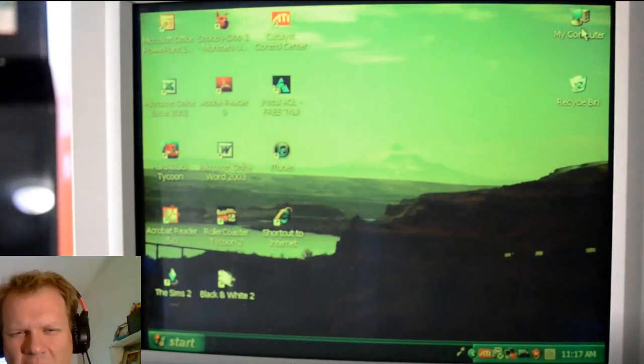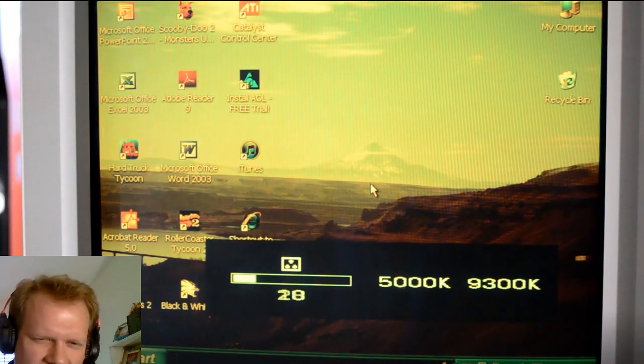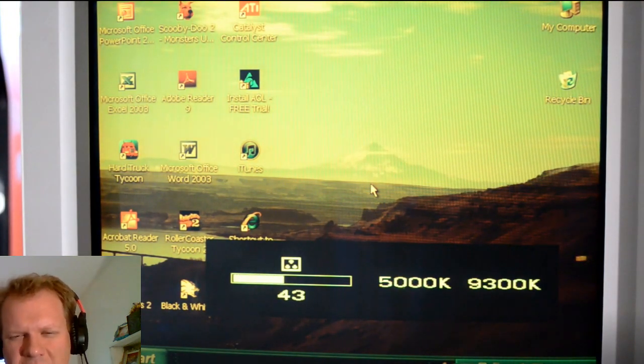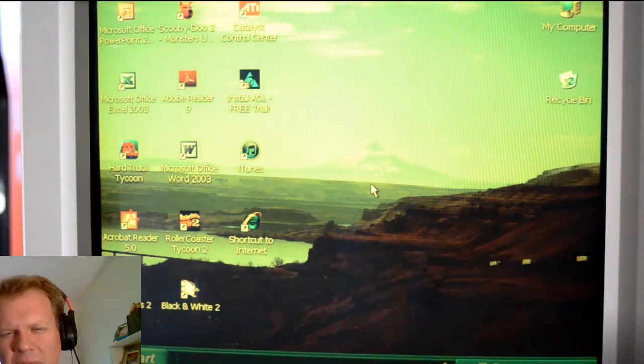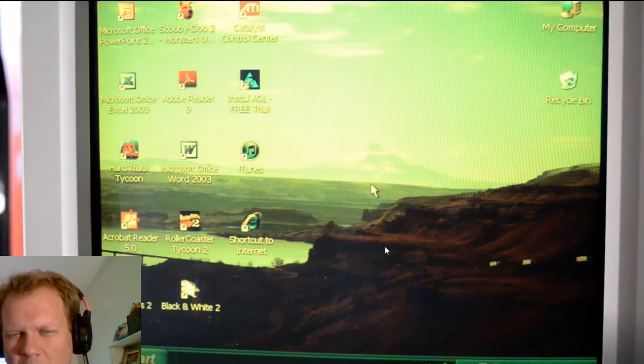And right away, I turned it on, and I could tell that we have a problem with brightness. The first thing I wanted to do was check the color temperatures, and it just looked like we were missing one of those colors. I had a feeling, since the screen didn't really look robust.